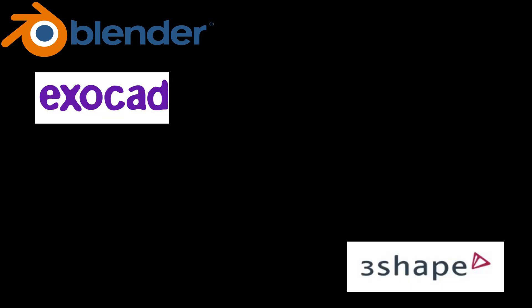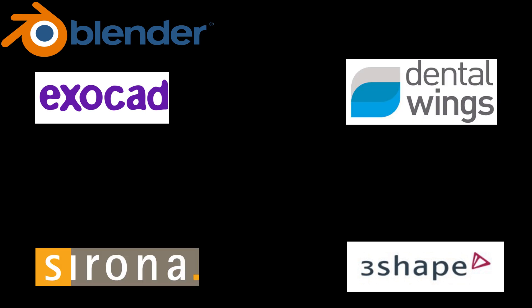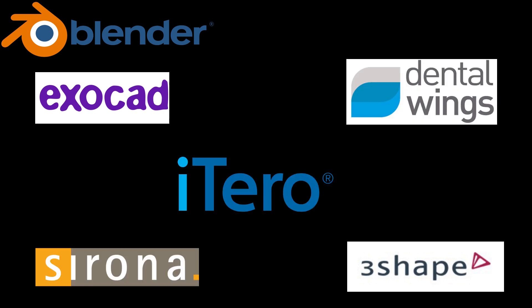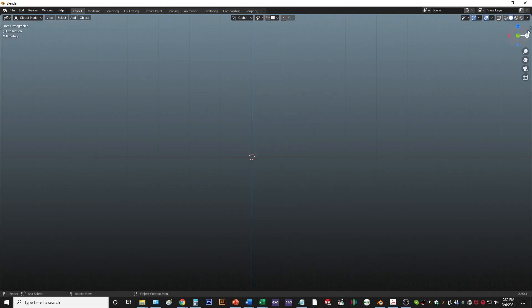First, you make your models in ExoCAD, 3Shape, Dental Wings, Serona, iTero, anywhere - it doesn't matter. You finish your models there, then you pull it into Blender. Let me show you how it works.